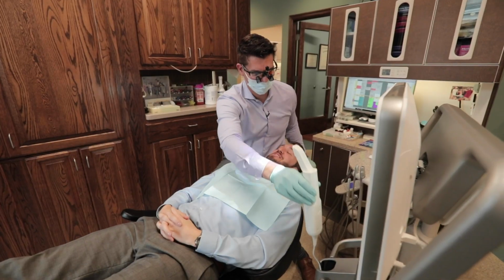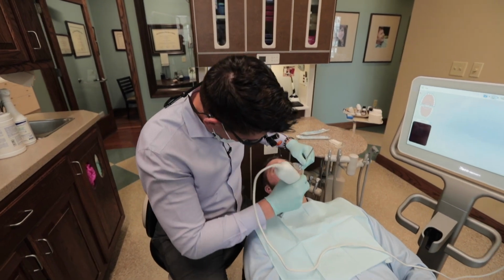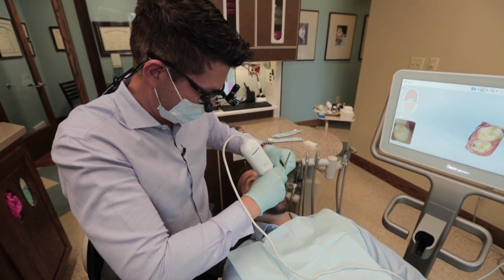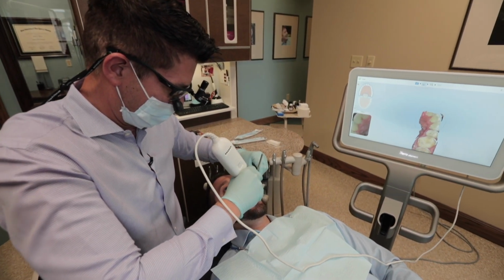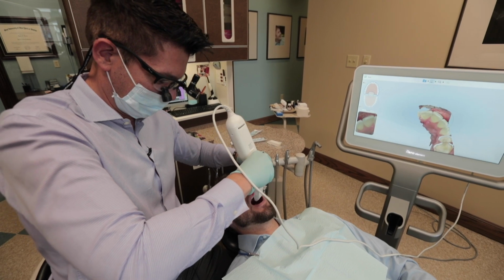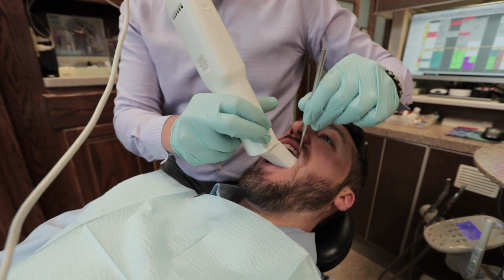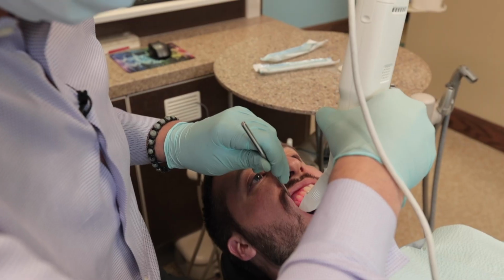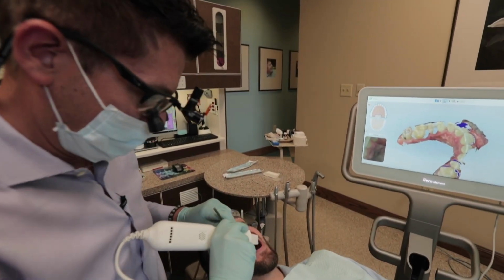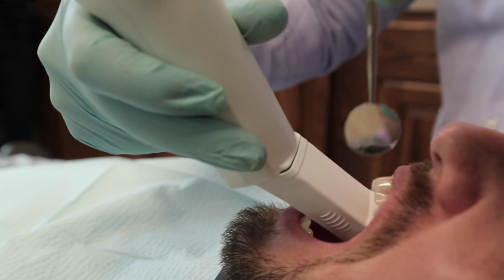Just do new scan. Let's scan. All right, guys, from my limited knowledge, I'm going to work from posterior to anterior. I'm going to get my lingual. I'm going to do a little rocking and rolling. And then I'm going to come to the other side. It's pretty fast, super fast actually. I'm going to rock and roll. Now I'm just kind of playing, so I apologize in advance, but you know, it's super fun.